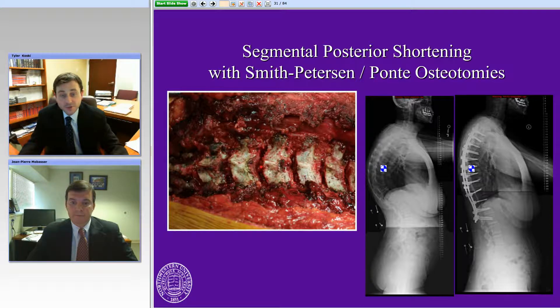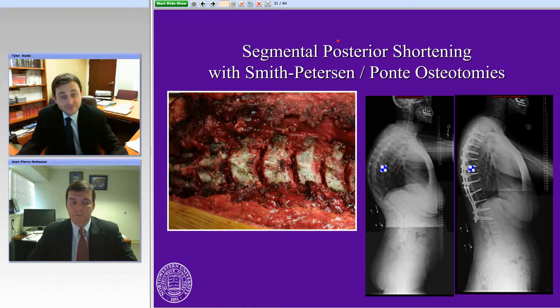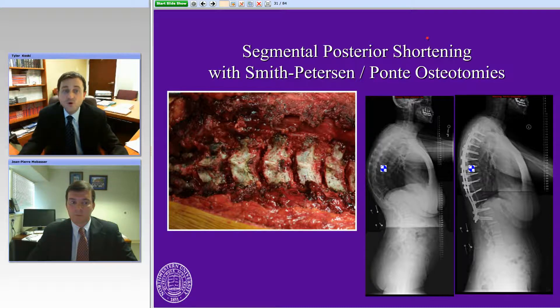You can see in the picture here, spinous processes have been partially removed. The inferior aspect of the lamina has been removed, extending out through that facet joint and removing all of that facet material. Then with segmental instrumentation, you can simply compress on those and close those osteotomies, getting a small correction — maybe 5, maximum 10 degrees at each level. You can see that X-ray here: a significant thoracic kyphosis is segmentally realigned over a long construct, a harmonious correction that works quite well in many cases.